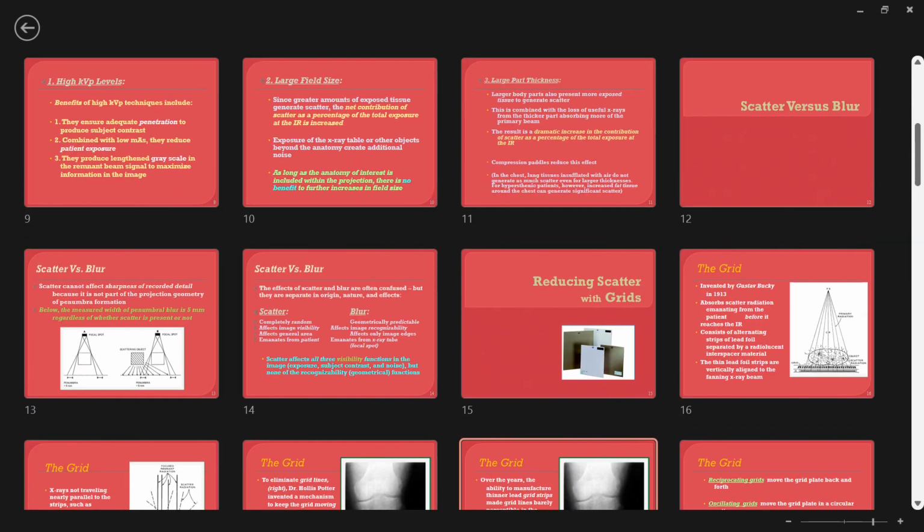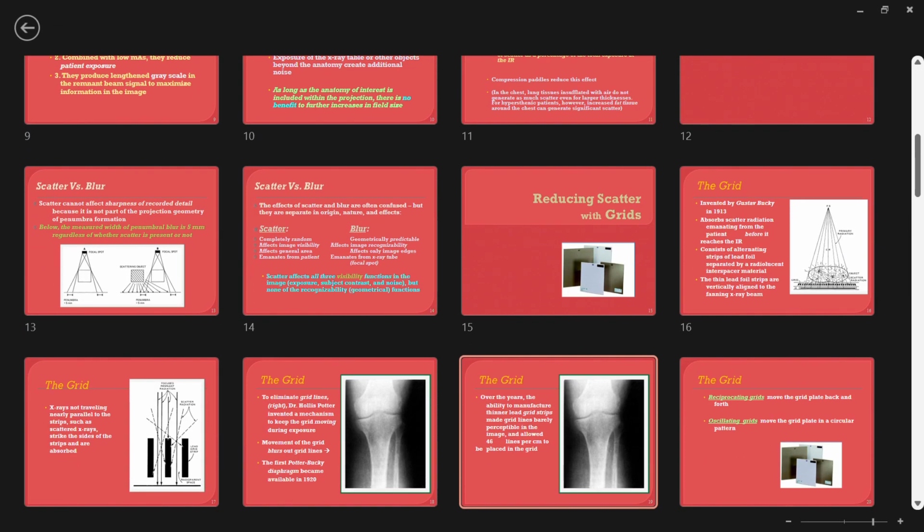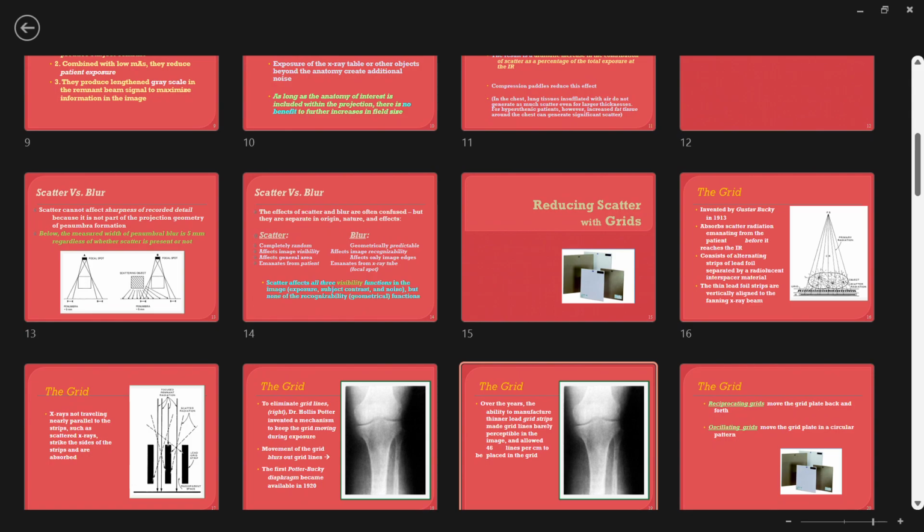So the gray haze on the outside of the bone is very clear. Just to the outside of the bone, the border of the bone. Like that? Yeah. So okay. Where your hand is, yep. That's cortex. Obviously, it's tissue. Yes. But then, do we also consider that scattered, that haze? There's a haze across there. So you understand what I'm saying?